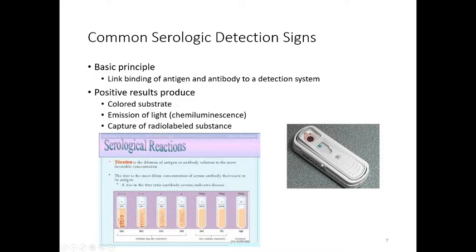For instance, this is a heartworm, Lyme, and Ehrlichia test. We also have a fourth one, I believe, testing for Rocky Mountain spotted fever, and so this would have an additional dot. And this is a negative test, and what we do is we mix the blood with a reagent and put it in this well here. We allow it to travel up the paper, and when it gets to this level, we snap this down.